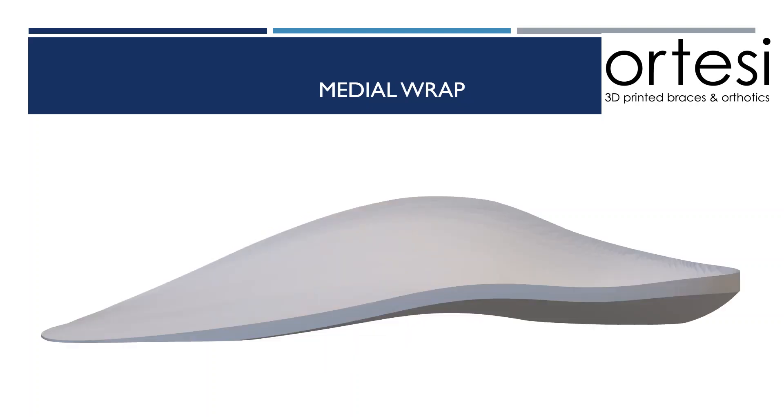A medial wrap is a vertical modification to the medial edge of the shell, increasing the vertical height of the heel cup extending into the arch. This is a modification to increase the transverse plane correction of the shell.